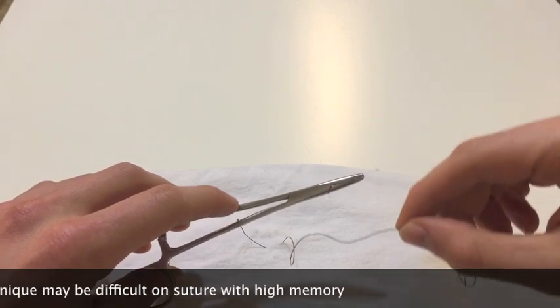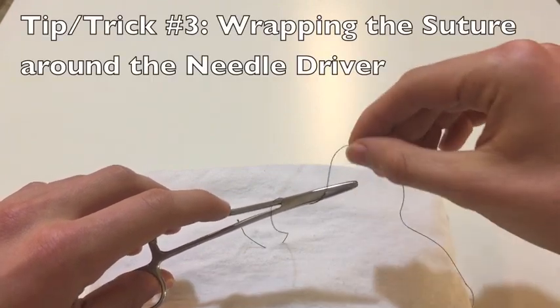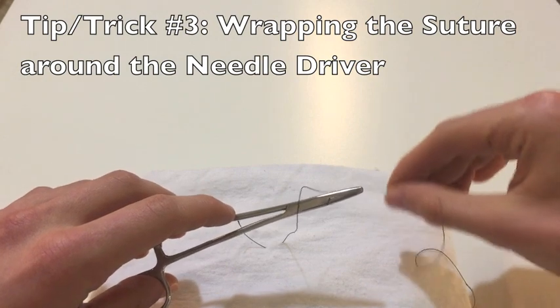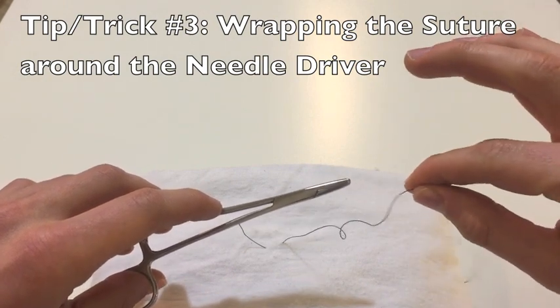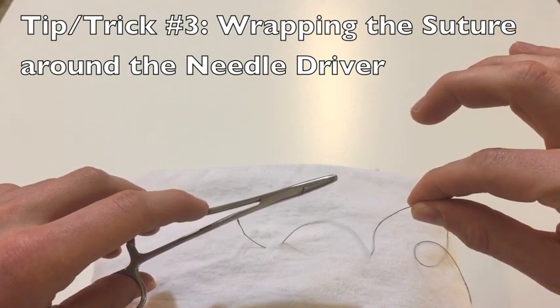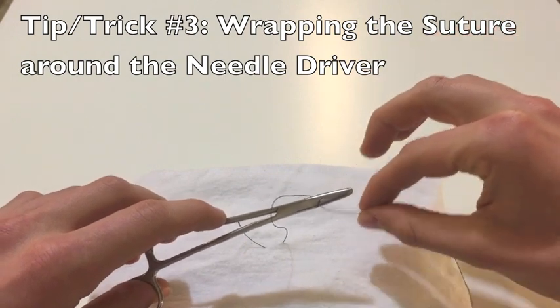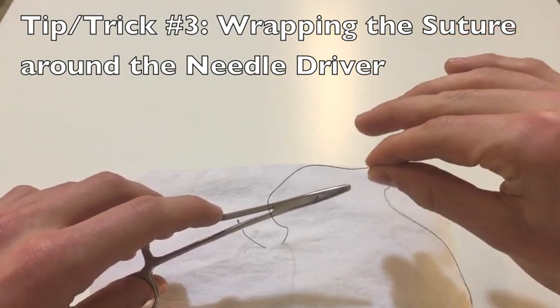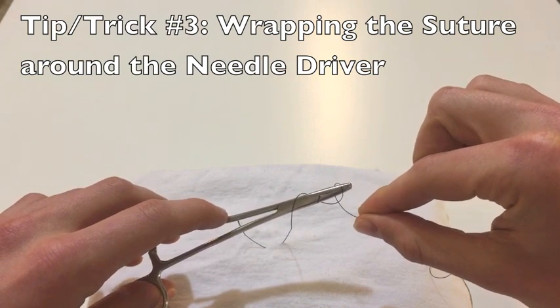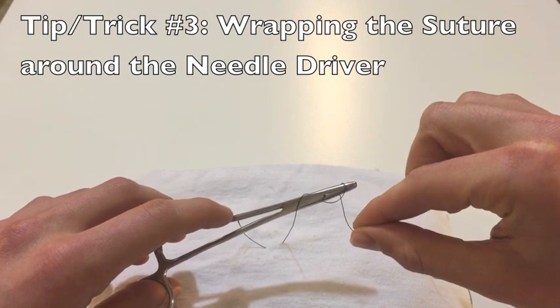To spin that suture around your needle driver, you can do it grossly by moving your whole hand clockwise or counterclockwise. But in addition to that, you're able to spin the suture clockwise or counterclockwise in your fingers just by rolling your fingers. So when I'm moving my hand grossly clockwise, I'll also put a little spin clockwise on my fingers, and that helps to set up that surgeon's knot.